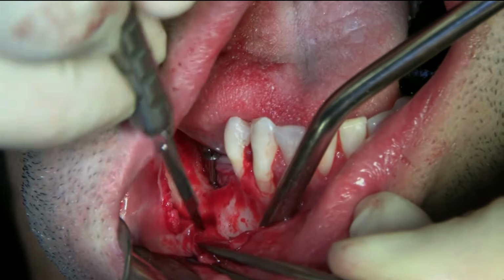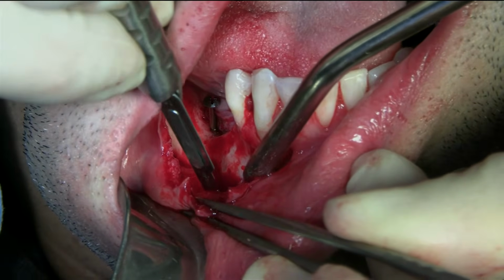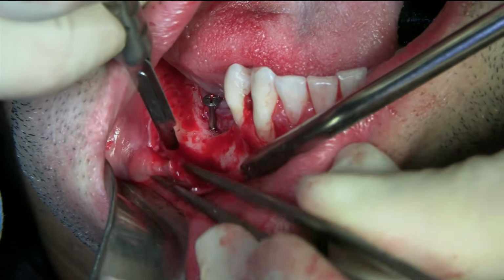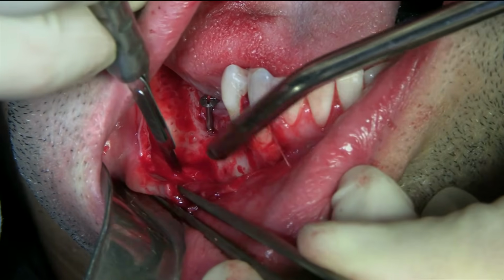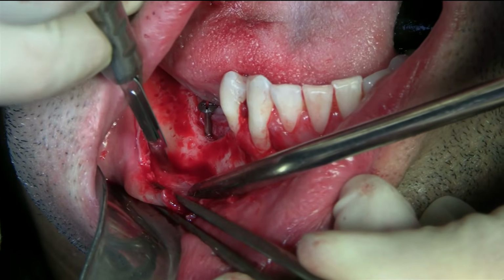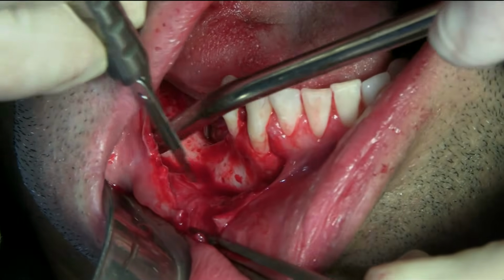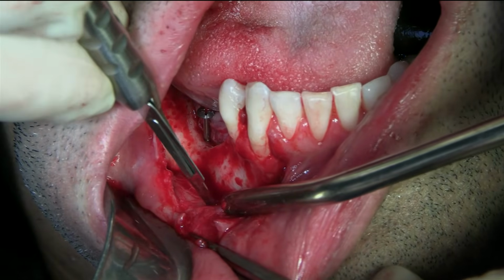Now I'm coming close to the mental foramen. Oh, sorry. The suction here, right there, where it's bleeding. Yeah, perfect. Can you see that, Tatjana? Yes. Got a little water to put that? Yeah, you can. Not in it, just from the top. You can give me water.